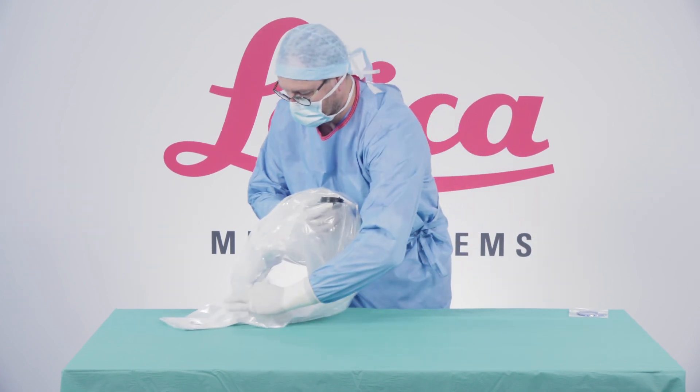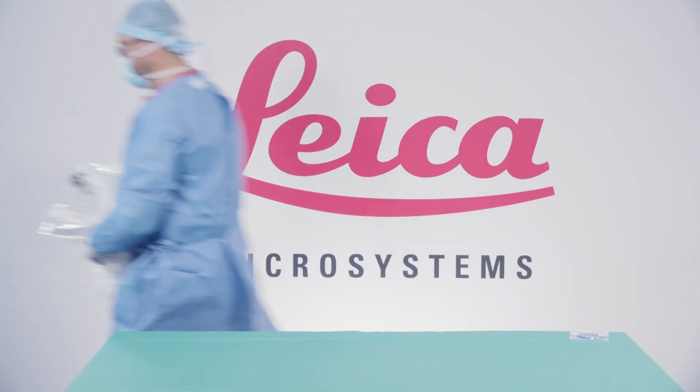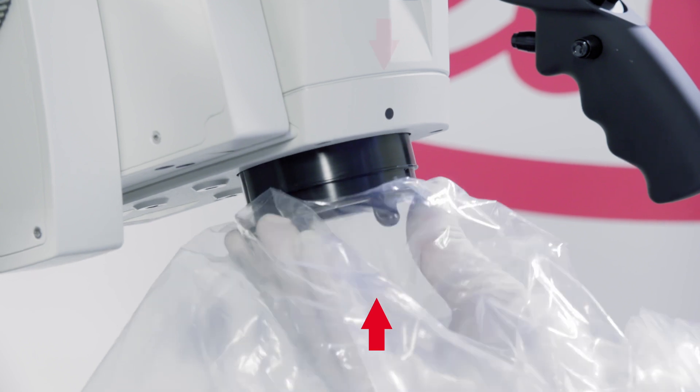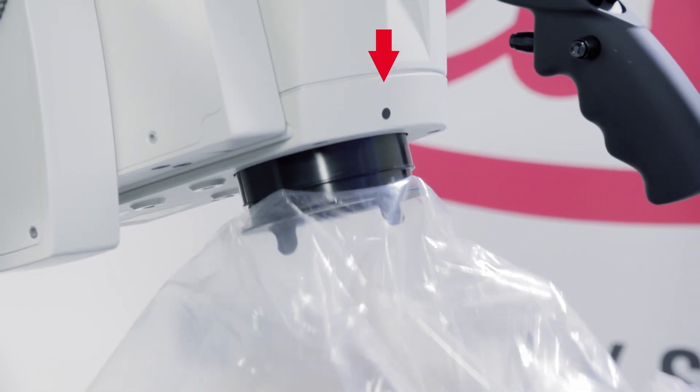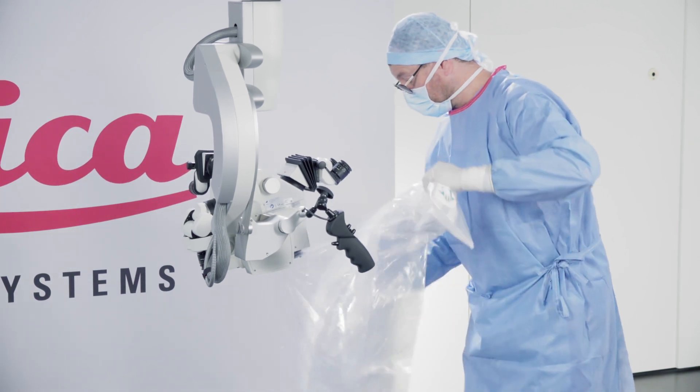Lift the lens cover and the remaining drape at the same time. Match the white dot on the lens cover with the black dot on the microscope and twist to the right until you feel it is secure and locked into place.